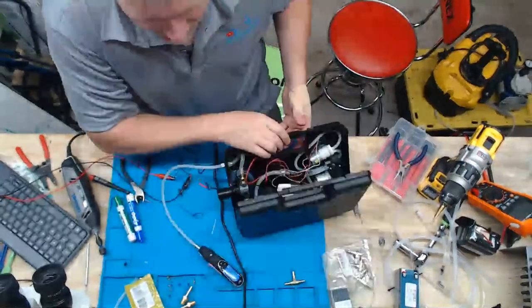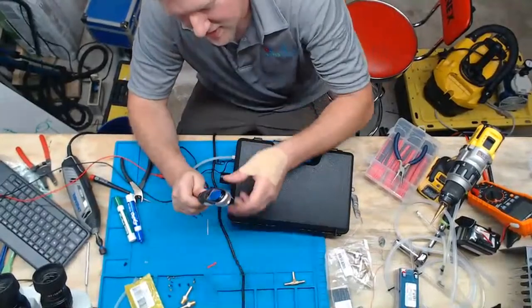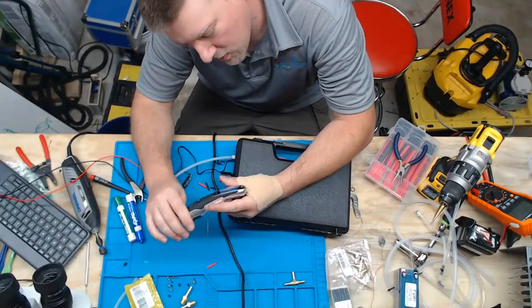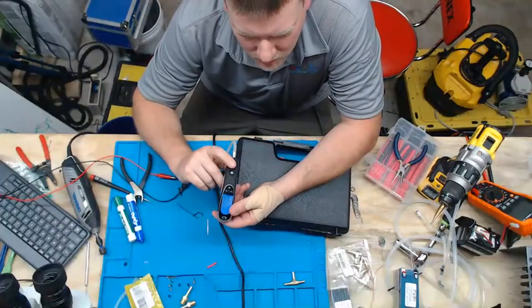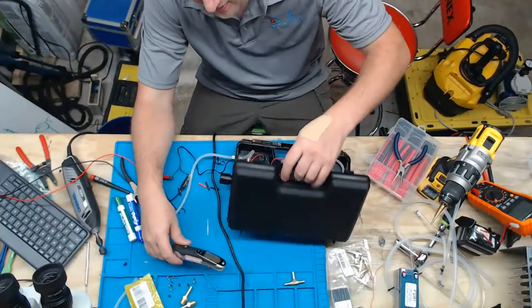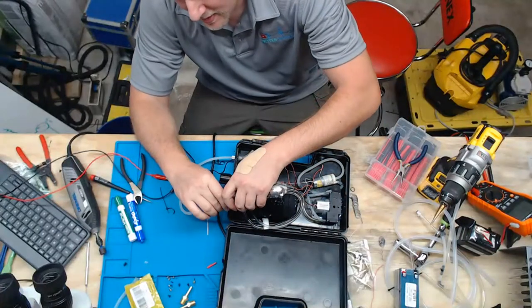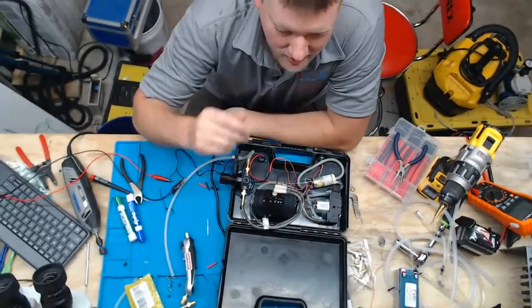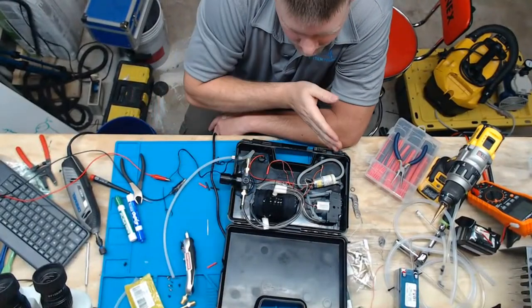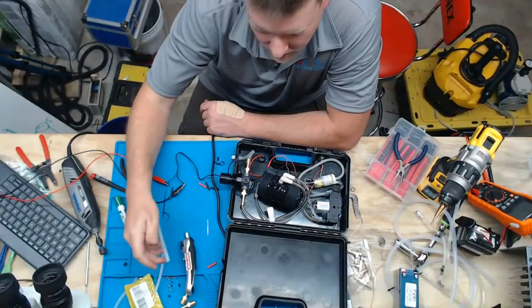And on this side, I'm sitting at 22 PSI. All right, I need my digital manometer. All right, it is what it is, guys. This guy is a piece of garbage, and I can't get it to stay on. Oh, my bad. I'm reading it upside down. 17 and a half PSI, so it's reading high. Anyway, I figured I'd give it a shot, and I just need to find the correct barrel connector to go to this guy. And it should be ready to test out.